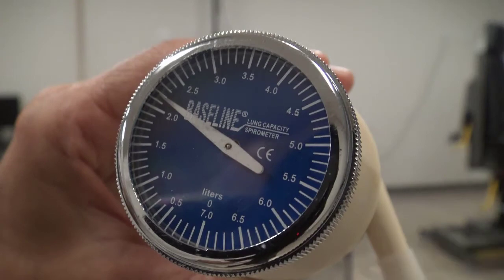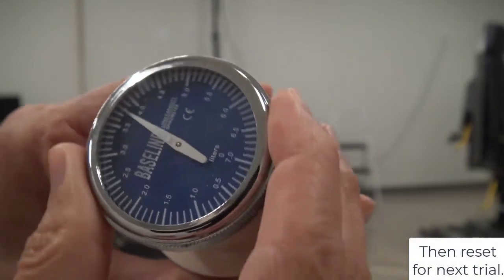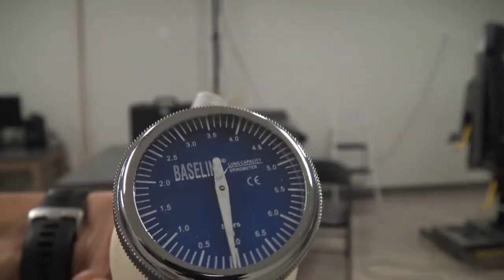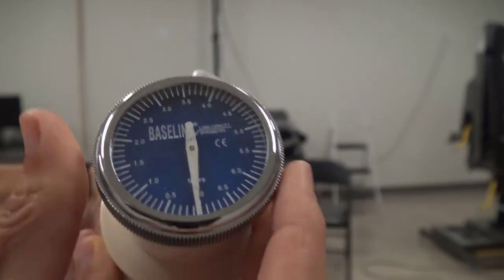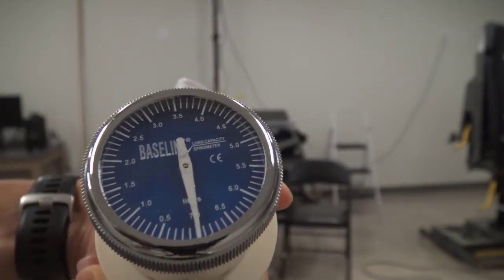In this case, we have about 2.2. Then you reset it for the next trial. So you see it's down by the 0. Let's reset that a little bit better there, right on the 0 mark.